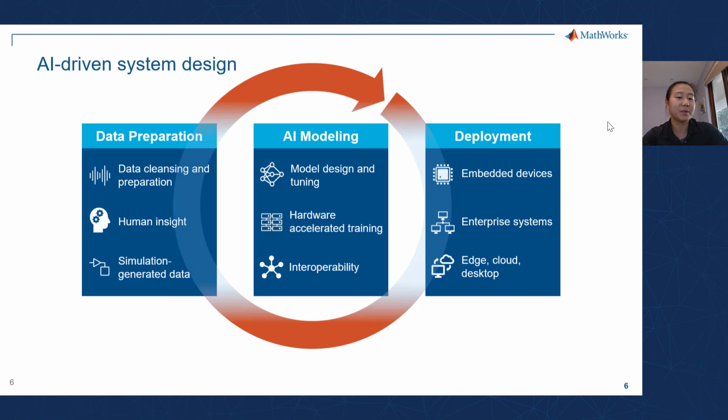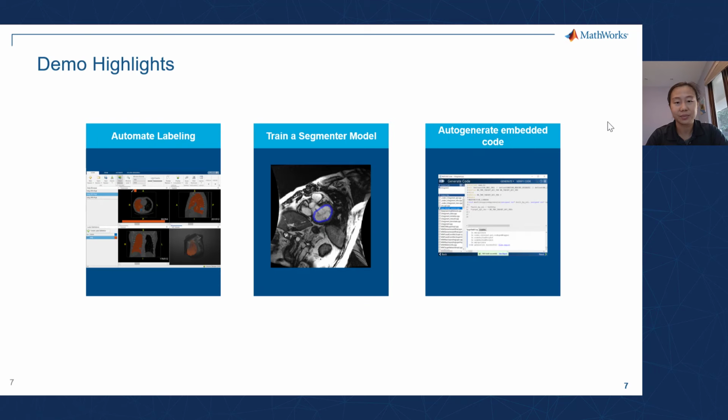And a thing to remember in this process is that even though we've presented it in a linear fashion, this is not a linear process. You will be going back and forth between the different steps. Data collection seems to be an ever-present and continuous need, and you're always going to be tweaking and improving your model, especially as that new data comes in.